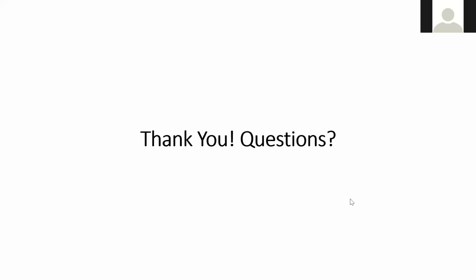Hi, excellent talk, Radha. Thank you, it was very refreshing. I know we usually forget lung ultrasound so fast if you don't keep doing it. So Jeff, Michael, and Radha, just a question. Have you all seen any decrease in the use of X-ray as follow-ups overall when you are available as a team to do POCUS follow-up and provide clinical information? Are they still doing X-rays in spite of that, including in ICUs? I want to know from both places.